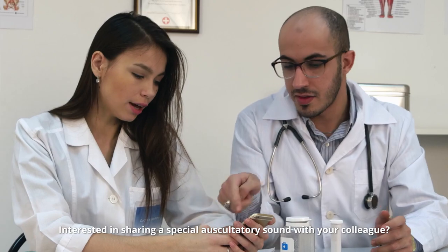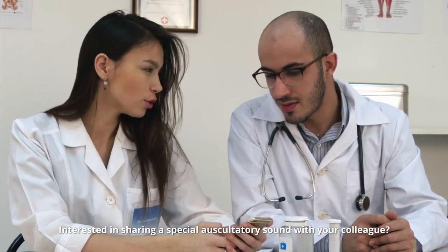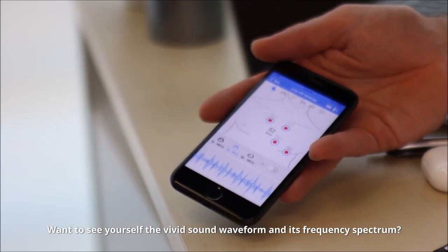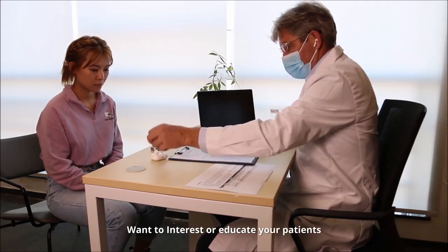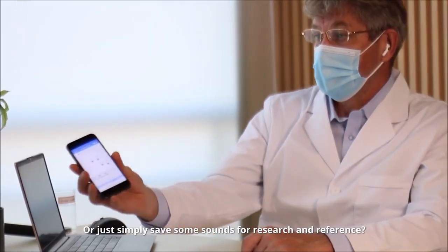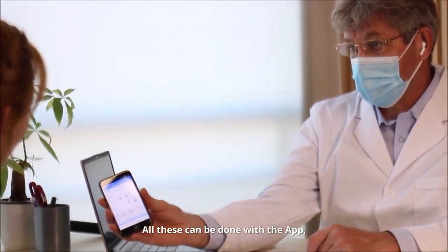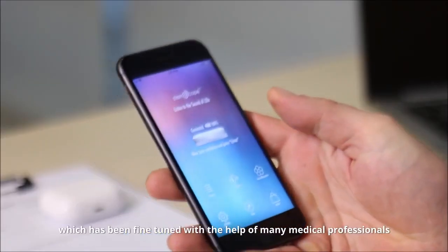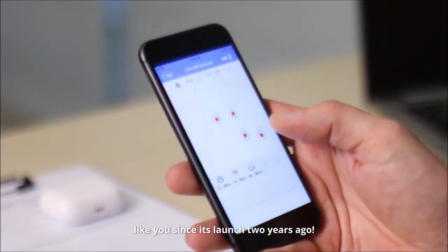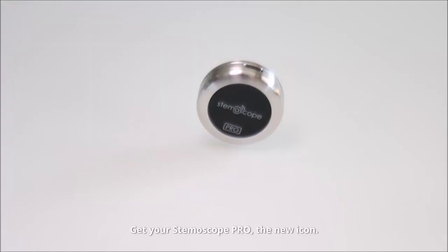Interested in sharing a special auscultatory sound with your colleague? Want to see the vivid sound waveform and its frequency spectrum? Want to educate your patients by letting them hear and see their own sound of life? Or just simply have some sounds for research and reference? All these can be done with the app, which has been fine-tuned with the help of many medical professionals like you since its launch two years ago. Get your Stemoscope Pro, the new icon.